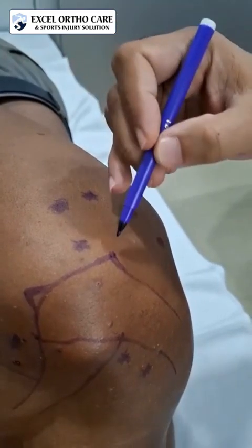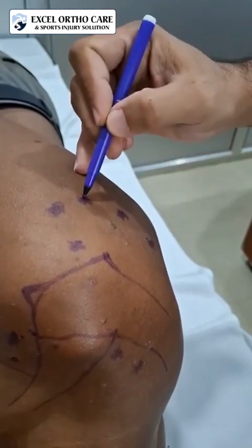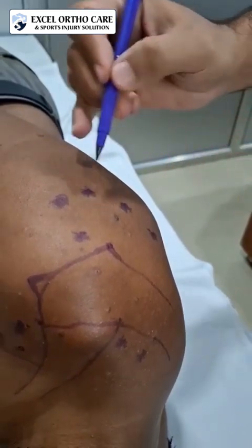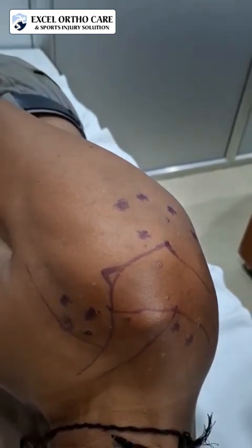Posterolateral portal is 3 to 4 centimeter inferior to the posterolateral corner of the acromion and 4 centimeter lateral to the standard posterior portal or the posterior portal. This portal is the viewing portal in case of rotator cuff repair and the subacromial decompression.